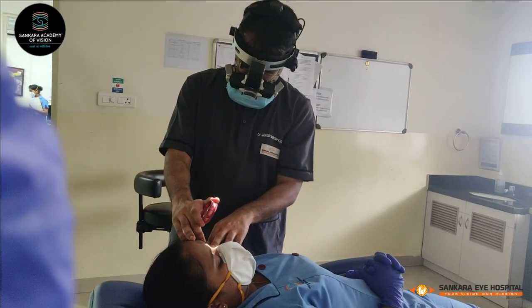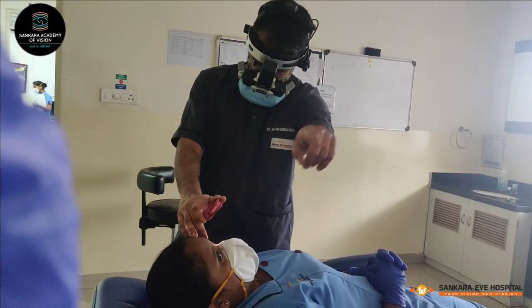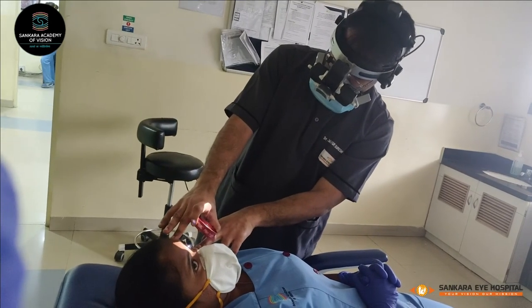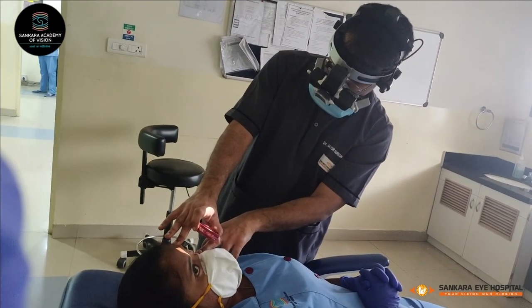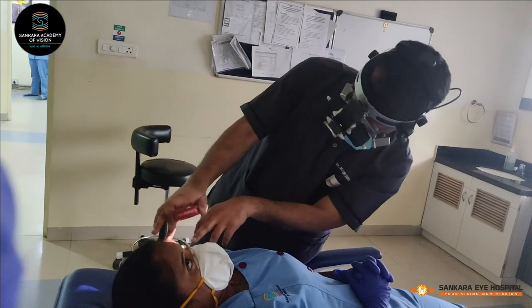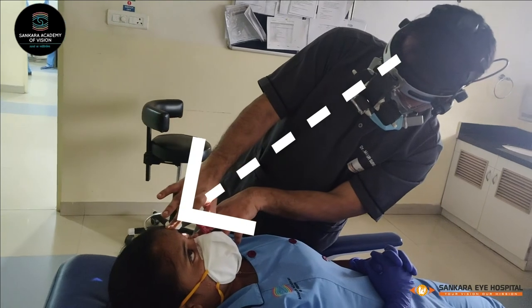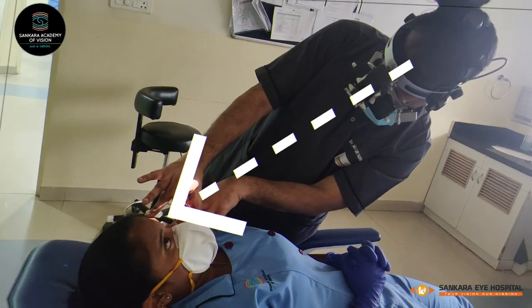You can also ask the patient to fixate on your outstretched hand. Maintain a common line of sight by imagining that the fundus, the center of the patient's pupil, the center of the condensing lens, and the examiner's visual axis are all connected by an imaginary line.